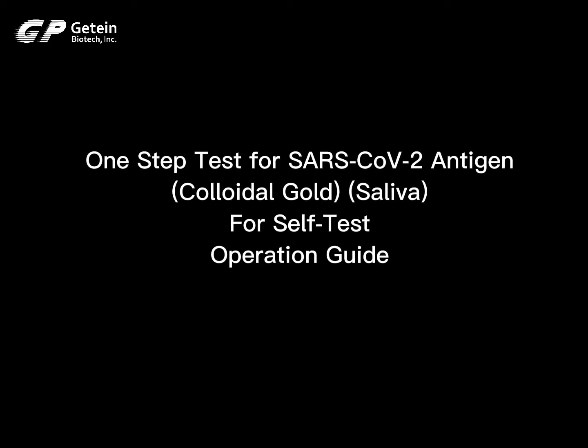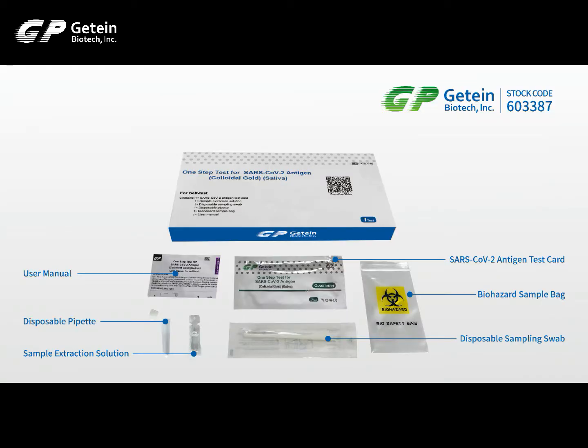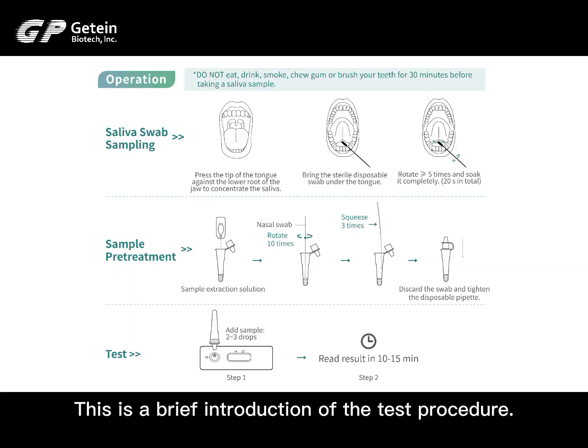One step test for SARS-CoV-2 antigen colloidal gold. For self-test operation guide. Test kit contents. Test procedure. This is a brief introduction of the test procedure.